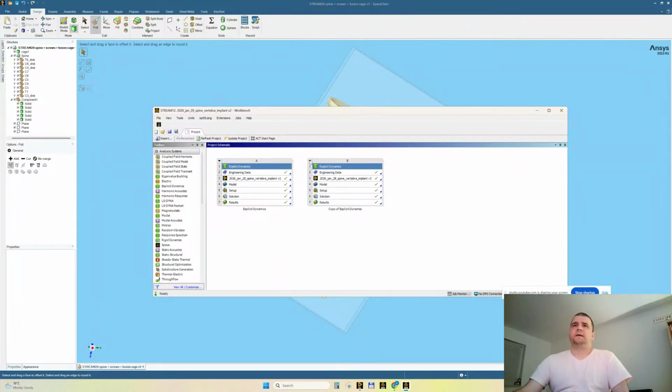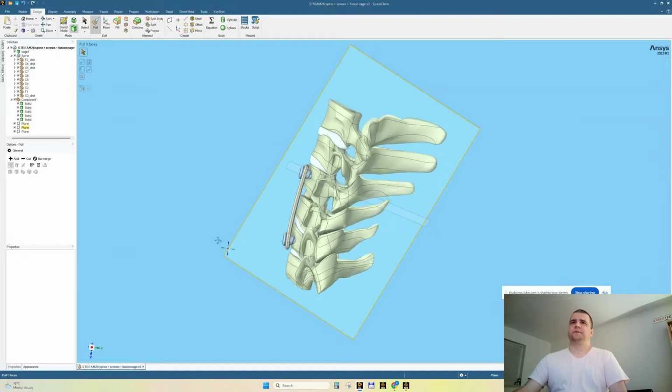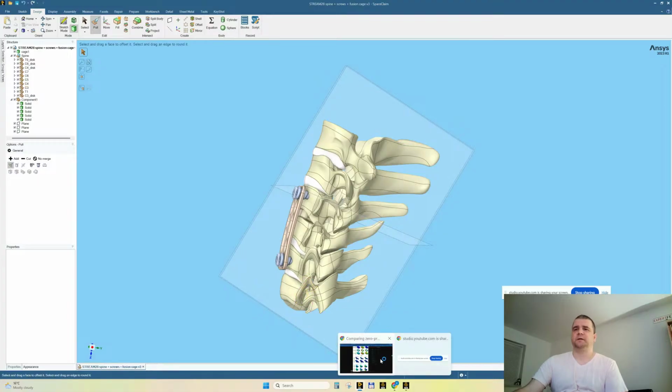I will duplicate what I had in livestream 12 because I have kind of the proper materials. Kind of, they can be improved. And this is what I'll be using. So yeah, let's do it. I would like to copy paste. Should I copy paste? No. I kind of wanted to move my 3D model into my work directory, but not at this time.